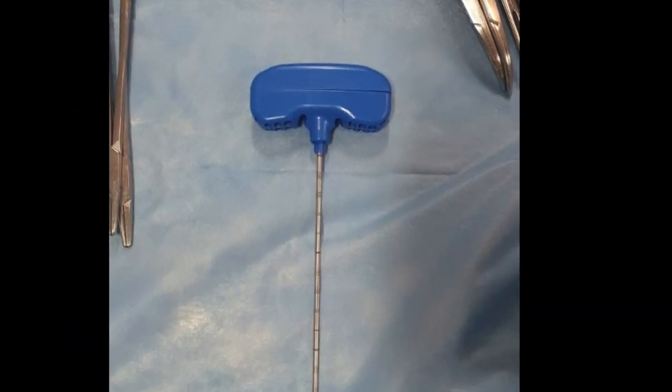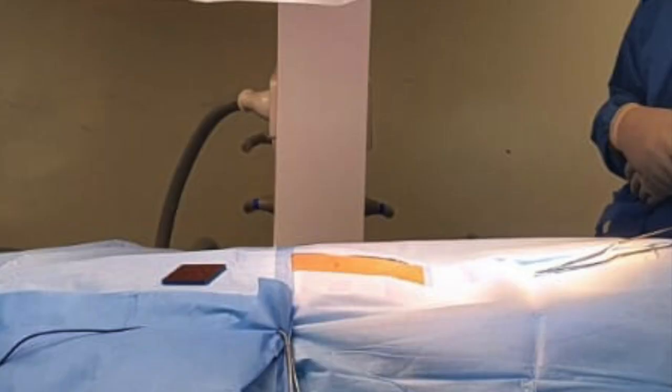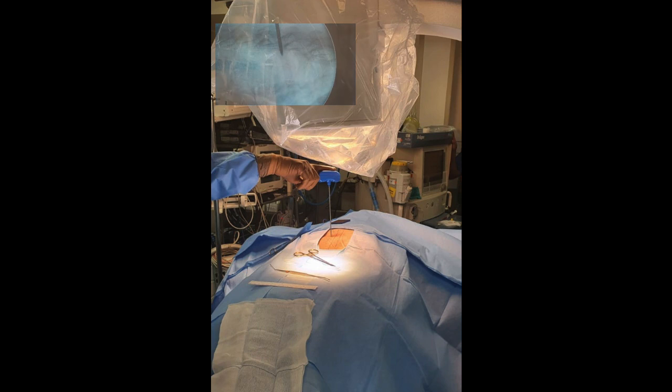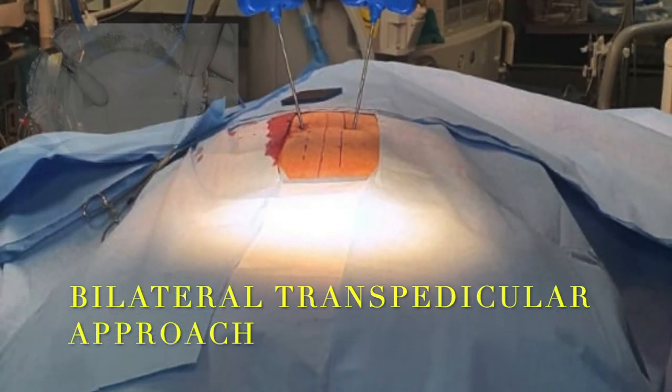This is the Jamshidi needle, which is passed through the pedicle into the vertebral body. The patient is in a prone position, and the Jamshidi needle is passed into the vertebral body under C-arm guidance. The needle should be exactly in the center of the pedicle.